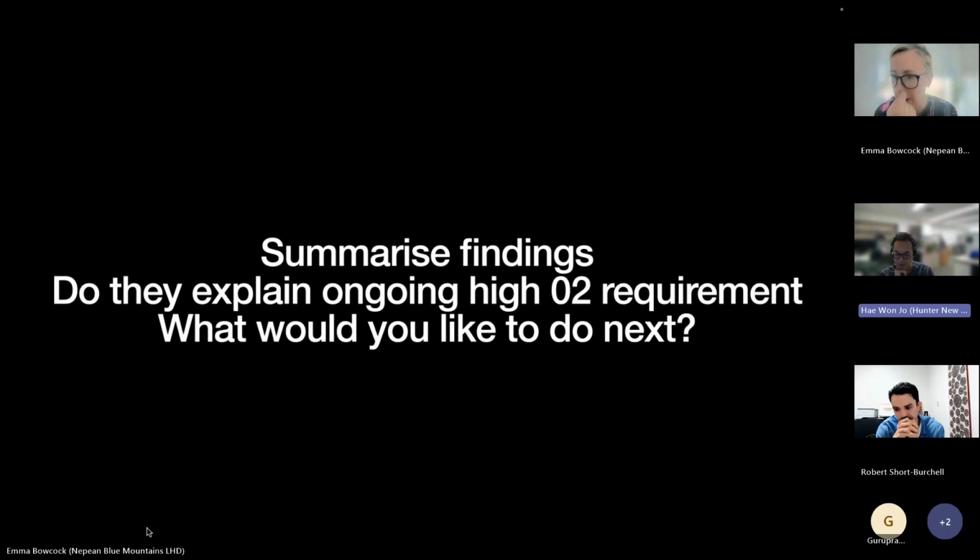The other thing I would like to look at from a diastolic function point of view, what I would do is try diuresis, and see if there's an improvement in values such as E to E prime, and the E velocity or decel time. If there is significant improvement, that might indicate that diastolic dysfunction is the main driver of dyspnea.